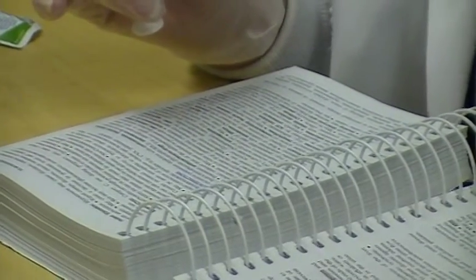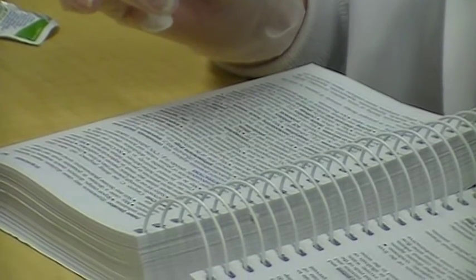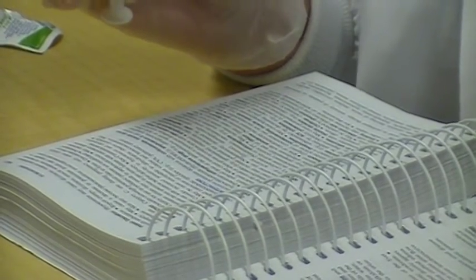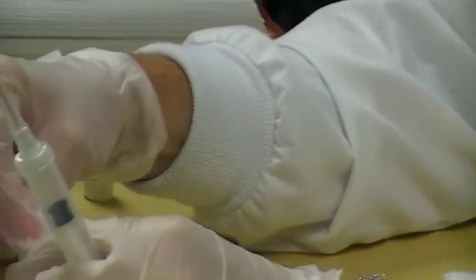If you look at the rate of administration for furosemide or Lasix, it says that 40 milligrams can be given over 1 to 2 minutes. We're giving 20 milligrams, so we could halve that, so 30 seconds to a minute. So I'm going to place this over to the side. Again, I'm going to clean my port for 5 seconds.